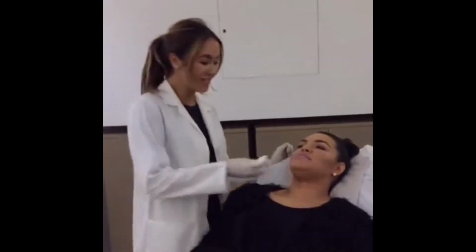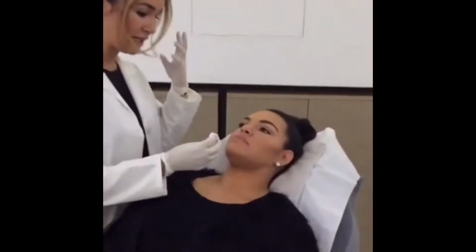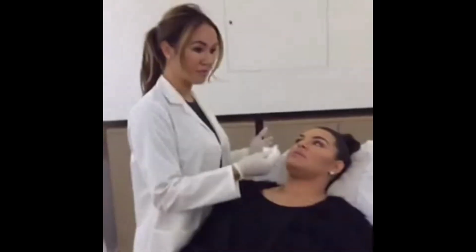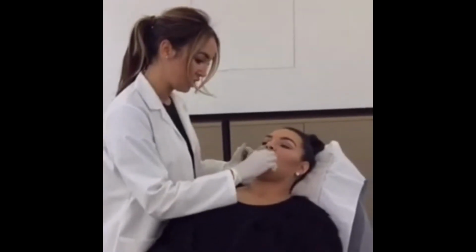Of course she gets a choice. I think Natasha's got great features, lovely big eyes, really nice plump cheeks. So she wants to try and create a full volume look. She's definitely got the lip that we can inject up to sort of 1 mil and get quite a nice full volume glamorous look on her.